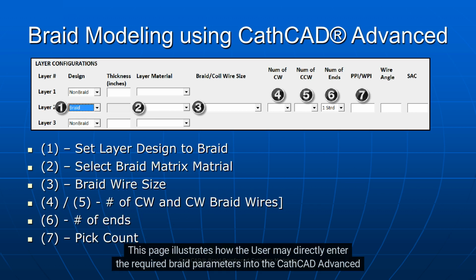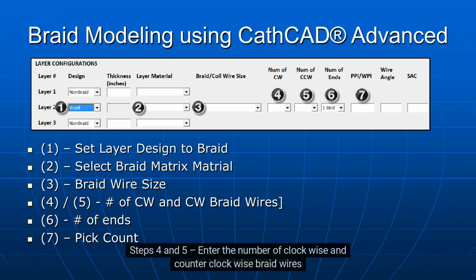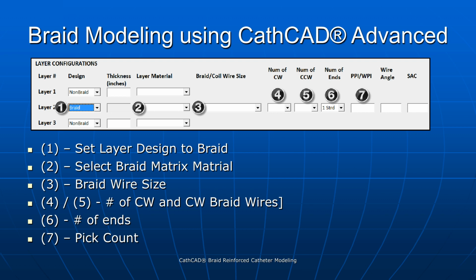This page illustrates how the user may directly enter the required braid parameters into the CathCAD advanced software package. Step 1, set the layer design to braid. Step 2, select the braid matrix material. Step 3, select the braid wire size. Steps 4 and 5, enter the number of clockwise and counterclockwise braid wires. Step 6, select the number of ends. Step 7, enter the pick count.